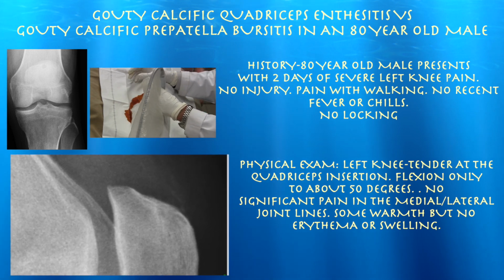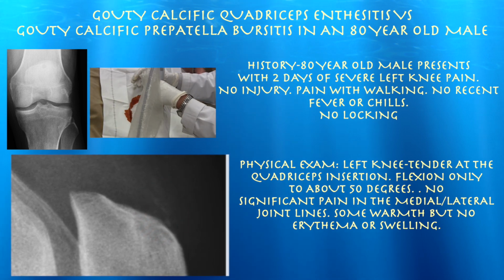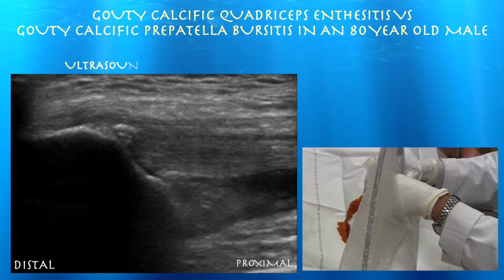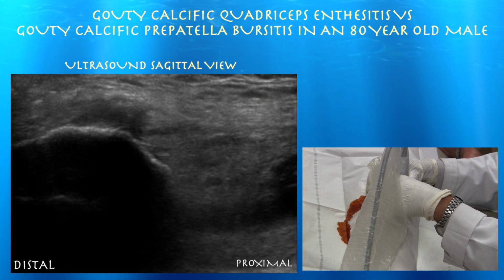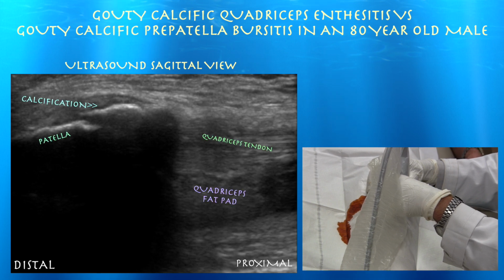I'm going to go ahead and do an ultrasound. The quick ultrasound scan did show some fluid and I believe calcification at the quadriceps insertion. You can see the quad tendon inserting on the patella, which is on the left, and then you see all this calcification in the distal quad tendon. And I believe it's a gouty type of enthesitis. He has a history, I believe, of gout, and we aspirated his olecranon. He had a gouty olecranon bursitis, and I believe this is something similar going on, probably in the prepatellar bursa or insertion of the quad tendon, perhaps.